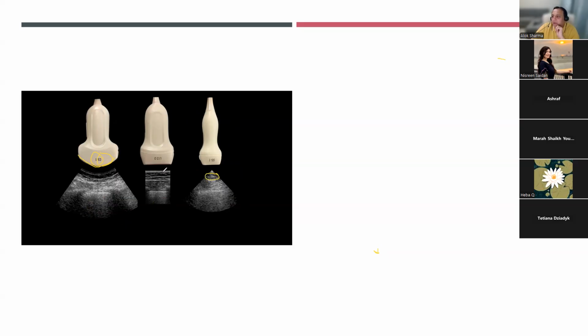But more importantly, I'm losing a huge amount of my footprint. It's giving me such a small footprint superficially that if I wanted to interpret subpleural consolidations in RDS, I'm barely going to see any. It's going to merge a lot of those images. And the B lines are going to be pretty tricky because they have to come out like this. I might get a slightly better image deeper down because the frequency is lower, but I'm not getting much of the pleura and the superficial structures. So in my opinion, a linear probe or a hockey stick are usually the standard probes that we use because of this footprint.